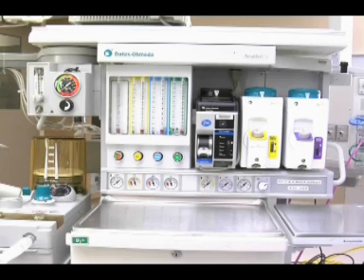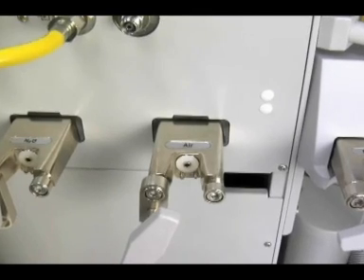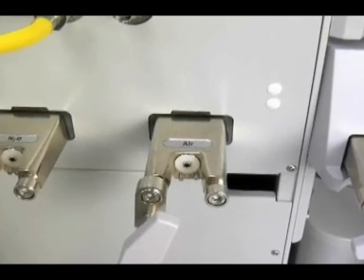Distal to the filter, there is a one-way check valve that prevents flow from going back into the pipeline source. The oxygen pneumatic power outlet is used to drive the ventilator and power the auxiliary oxygen flow meter.